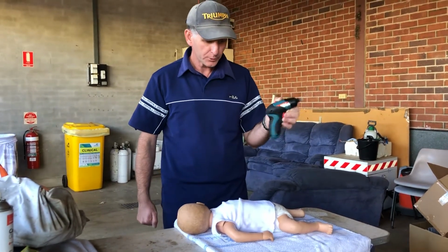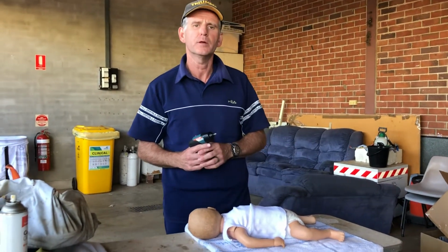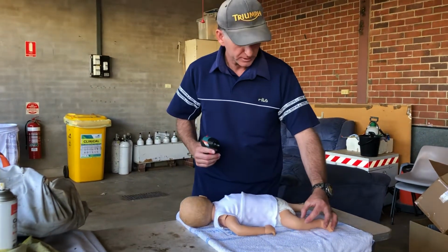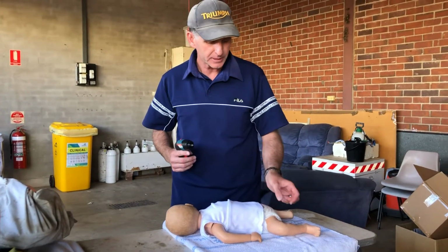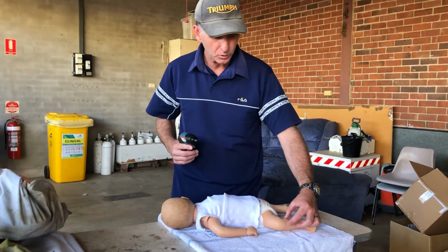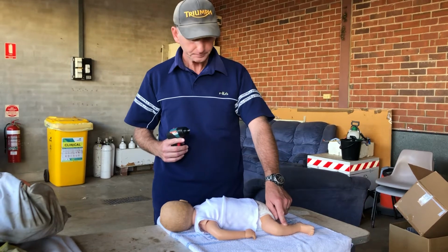So the first thing we do is work out where exactly we're going to put the EasyIO, the intraosseous needle, and we've decided we're going to use the tibial plateau here, just distal to the knee. The easiest way to do it is to work out 1 centimetre distal to the patella, slightly medial in the tibial plateau there.